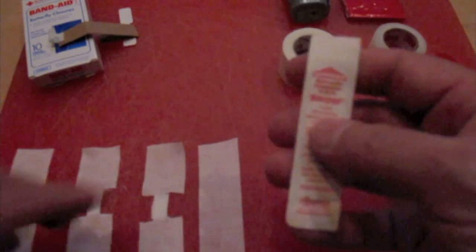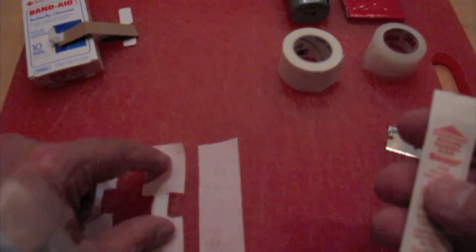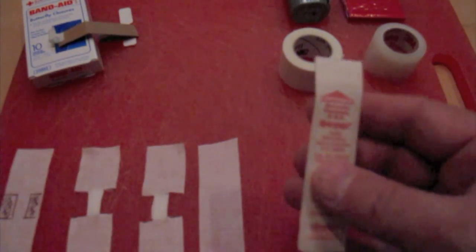One other little option, if you go to a large medical supply house, you can get tincture of benzoin. It comes in bottles, or in this case, which I think is more useful for our first aid kits out in the field, squeeze and paint ampules. This is basically a skin conditioner and adhesive adjunct that will make these adhesive tabs stick better to the skin.